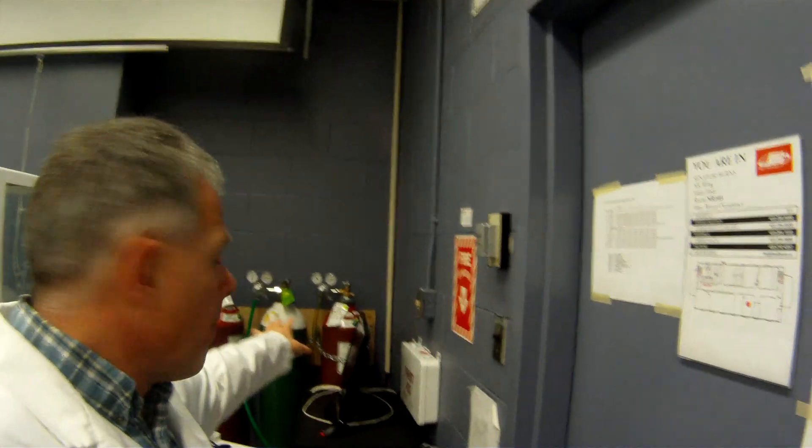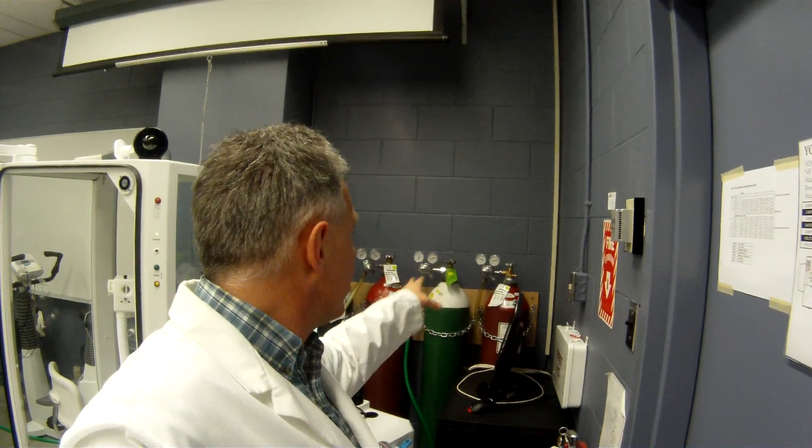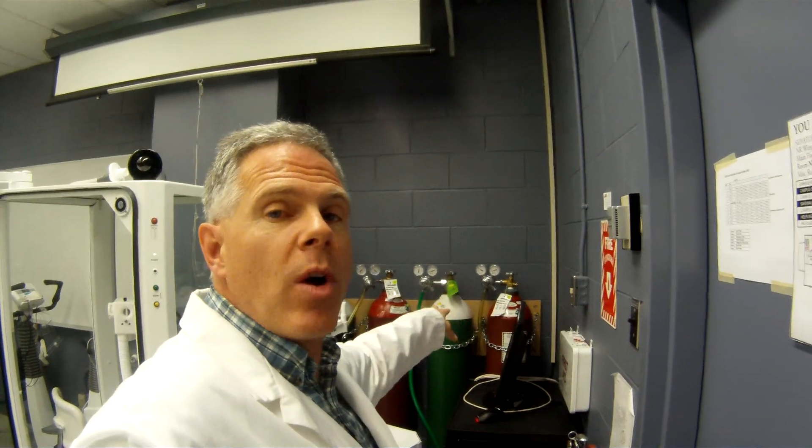Software's run off the screen. Back here, you can see we've got our gases — oxygen and our gas mixture for doing our nitrogen washout and DLCO testing.